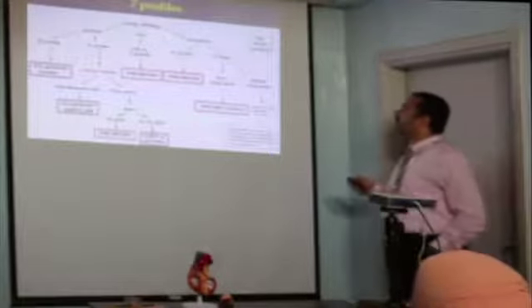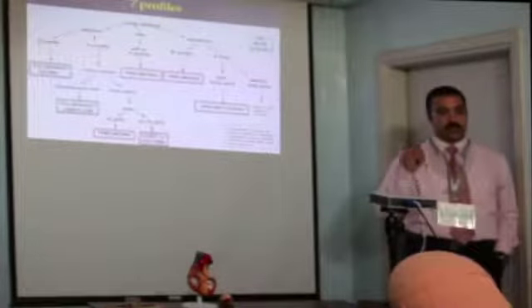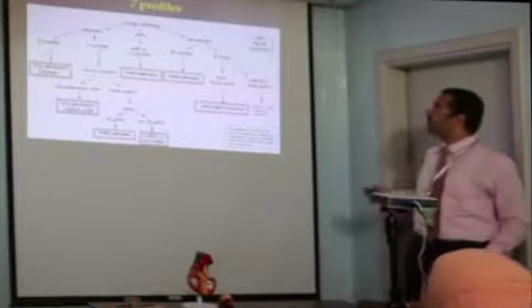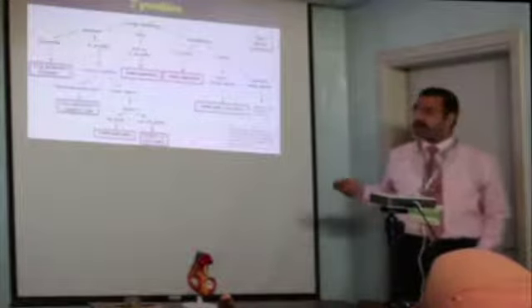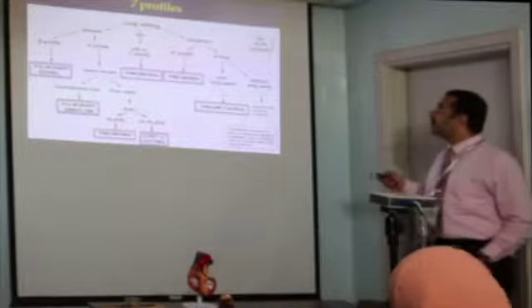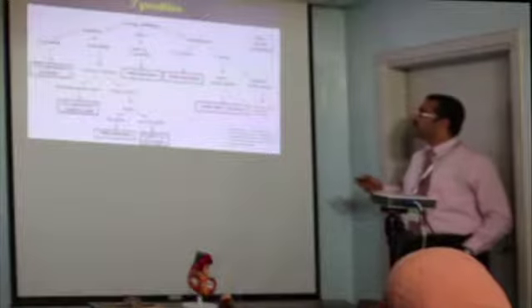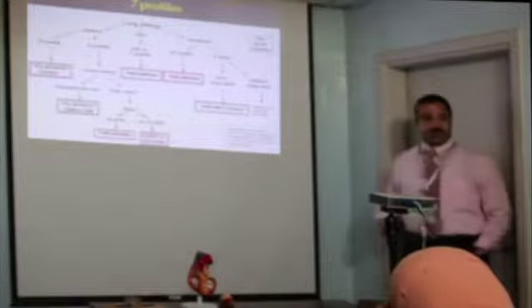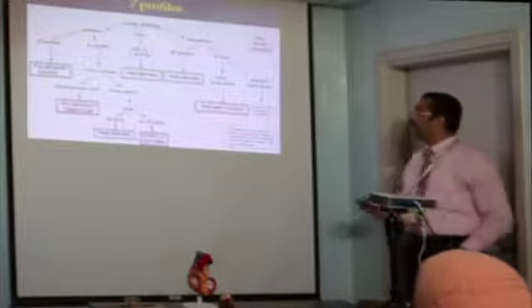Now, there is no sliding. You can swear there is no lung sliding, but just B lines. So we cannot actually call them B lines, because to get proper B lines there should be lung sliding. So it's called a B prime profile, and this is another indicator of pneumonia. So I can diagnose pneumonia in three ways. Pneumonia is a difficult diagnosis with ultrasound.